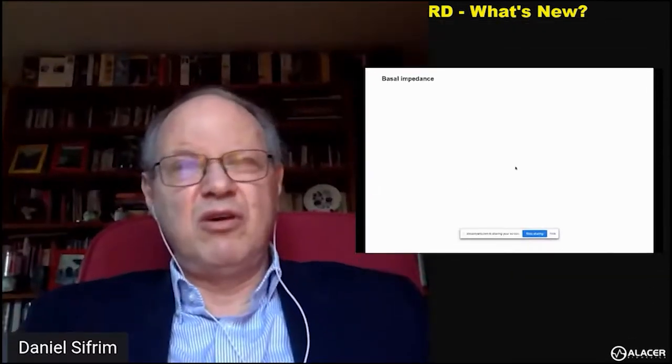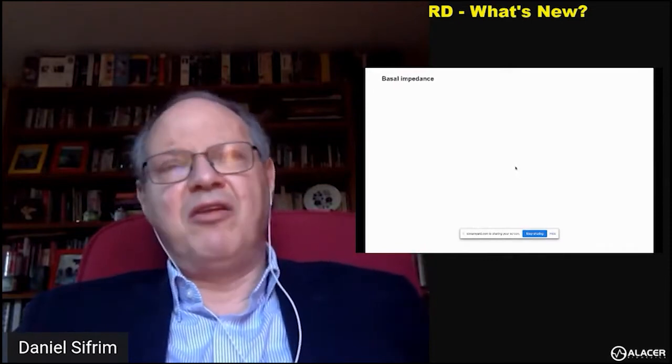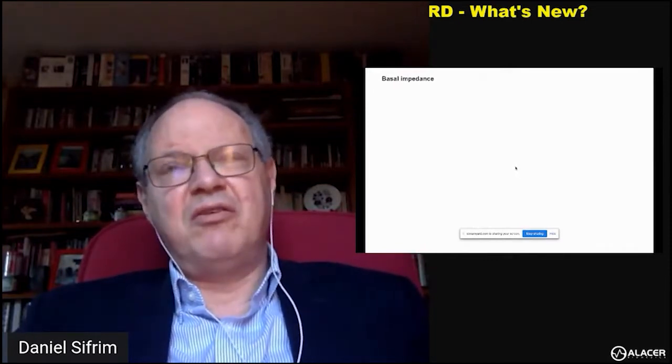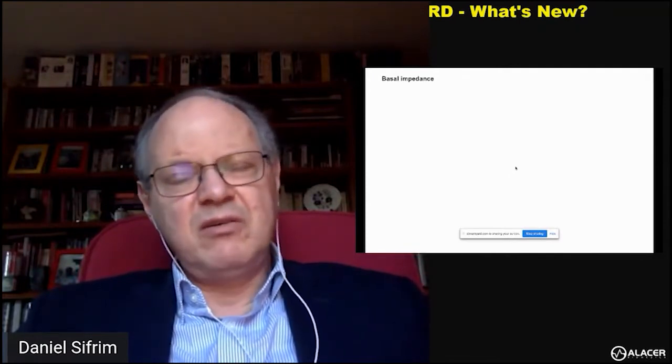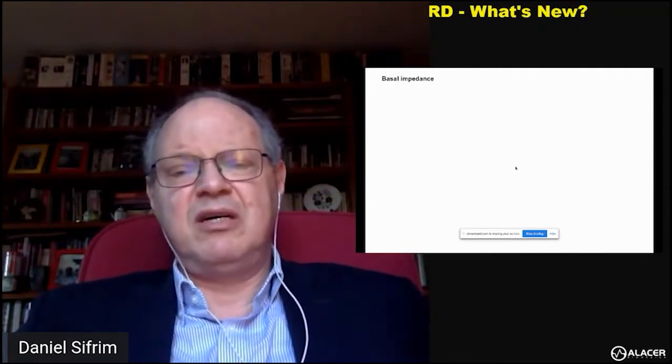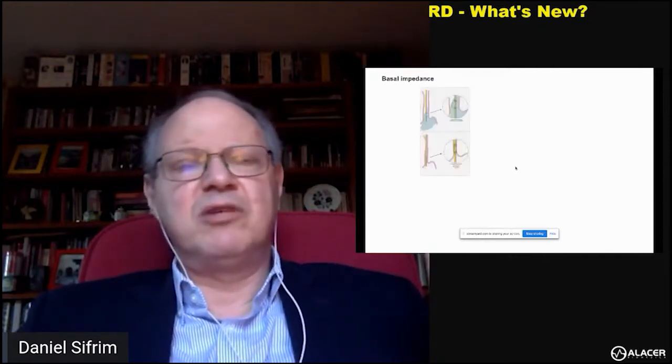So you want to know if the mucosa of the esophagus is healthy, or it is somehow touched by reflux. And impedance can give us a hint on the status of the esophageal mucosa.